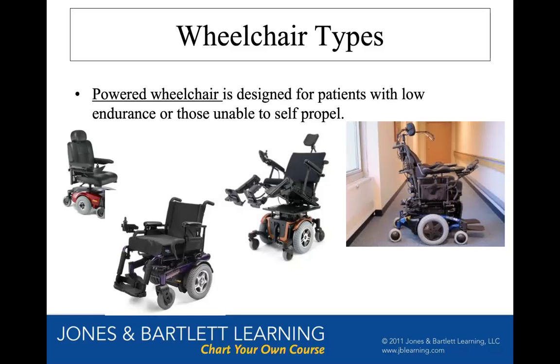Just to get off my soapbox with power chairs, there's also another way you can drive your power chair. They put sensors on a retainer, like a mouth guard made with your dentist, and then you wear the retainer in your mouth.